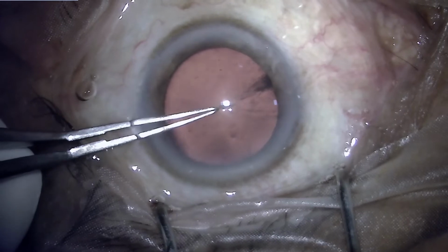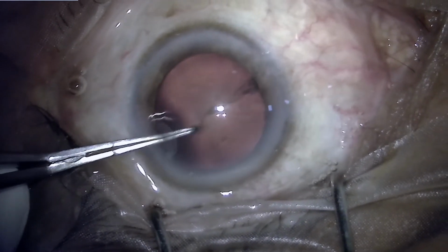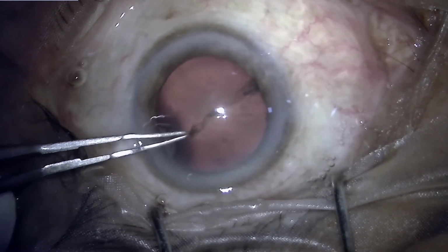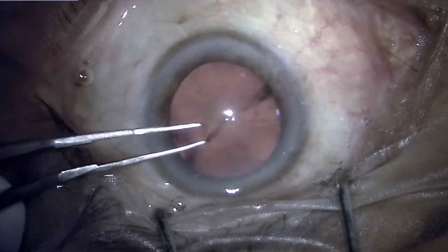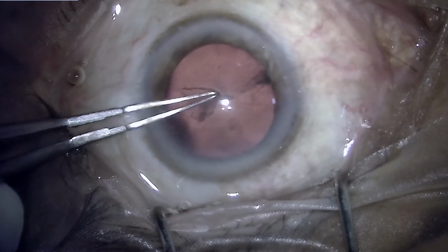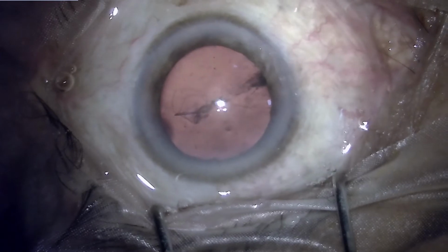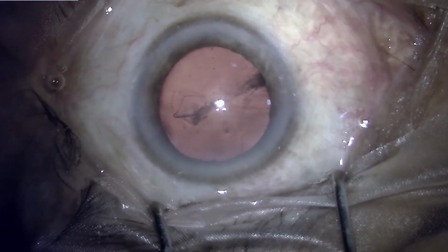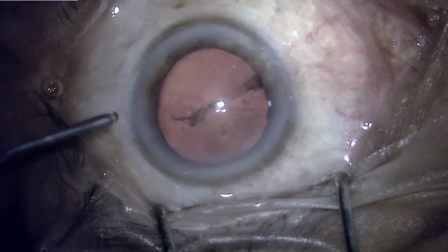So as usual, a clear corneal incision 2.8 mm under topical anesthesia, and this is the steep axis, so the main port has been created at that portion, and there was some unwanted movement by the patient at the exact moment when the flap was being created, so it has resulted into an extension. So now this needs some amount of management.